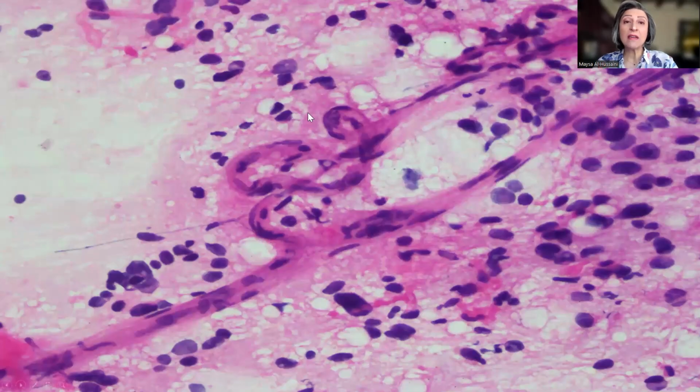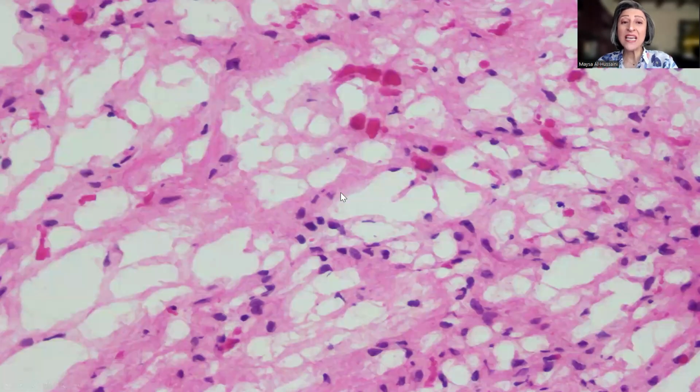However, in some areas there was evidence of what appeared to be microvascular proliferation or vascular proliferation. Again, another Rosenthal fiber here, and as you can see, a lot of pleomorphism. Now, the frozen section itself wasn't as cellular, I have to say, and it showed Rosenthal fibers and then scattered cells, some with pleomorphic features, but again, there was no evidence of apoptosis, mitosis, or necrosis.